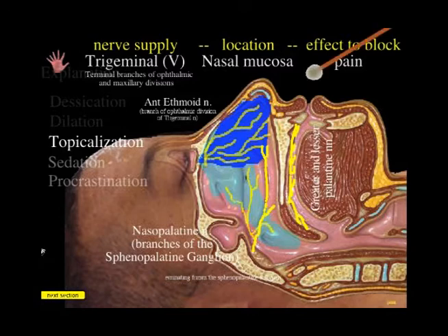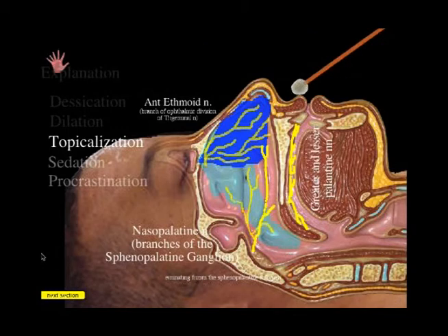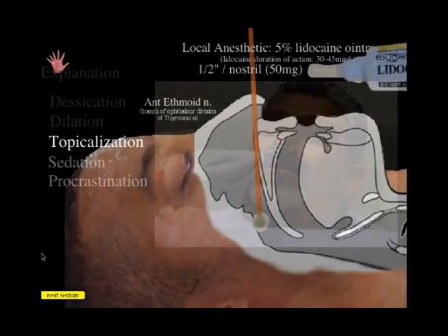I like to take cotton swabs. I fill them with whatever lidocaine I have available to me. Right now, I don't have 5% lidocaine ointment available to me, which was my favorite. So I'll use 2% viscous lidocaine. I'll just put those swabs in the nose, following the floor of the nose, until I come up to the sphenoid bone where my lateral nasopalatine nerves are coming.